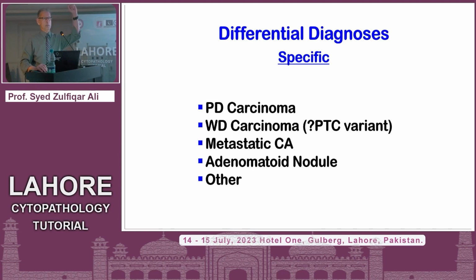So how many think it's benign? One bold person says it's benign. Very good. So metastatic carcinoma is there, and all you have to do is ask me a question and I'll give you the answer. That's a big question: history of a malignant tumor in the patient. That's a very good question also, because it will cover everything, right? So it's not melanoma, it's not adenocarcinoma. The answer is there is no previous history in the patient.